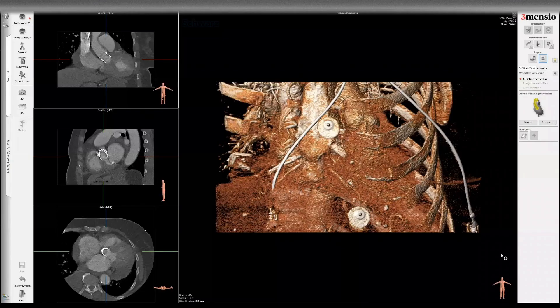Hello, today I'm going to show you the Femuncia workup on a patient with prior balloon expandable TAVR, now being evaluated for redo TAVR. This is a unique situation because, although it's rare to see patients with failed transcatheter heart valves, it's actually becoming increasingly common. So we're going to show you how we can do that.